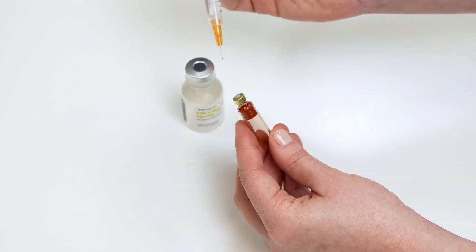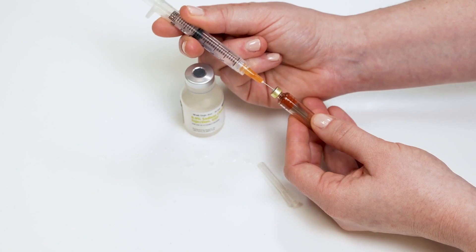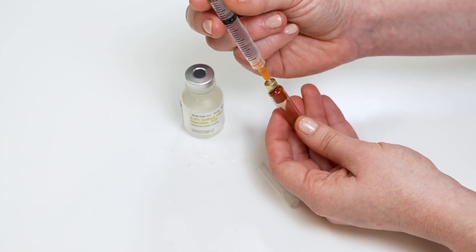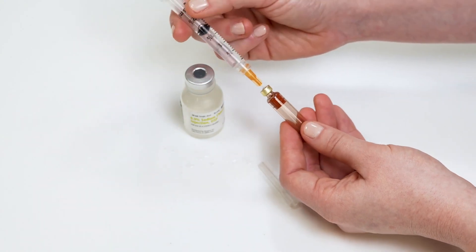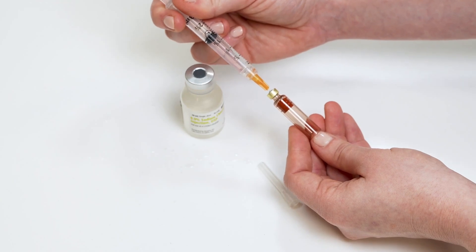To fill the islet cartridge, hold the cartridge with one hand and with the other hand, insert the syringe needle into the gray cartridge septum. Press down slowly on the syringe plunger rod to transfer the insulin from the syringe into the cartridge.